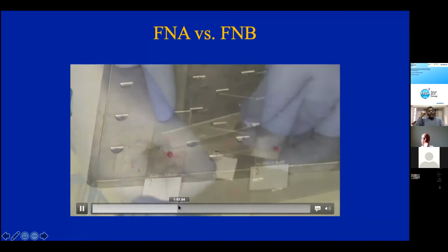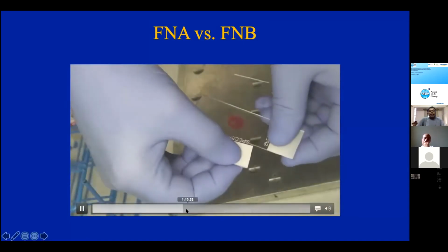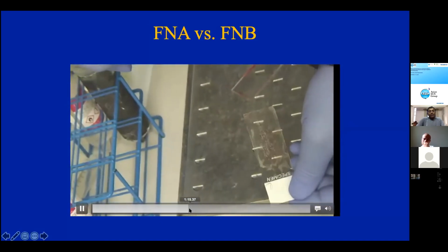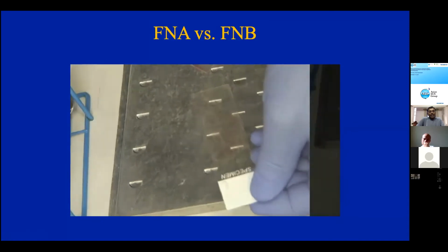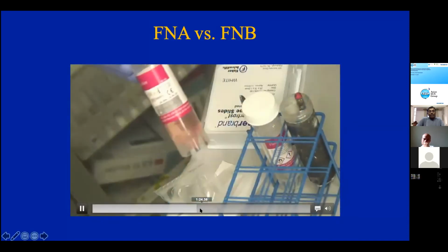And there you find the cytological aspirate. Then you smear it onto the slide. And then once you smear it on, you perform a few passes for cell block, which is usually the standard technique. And you can find a nice aspirate without any core tissue. The remaining specimen is now expressed into a cell block.